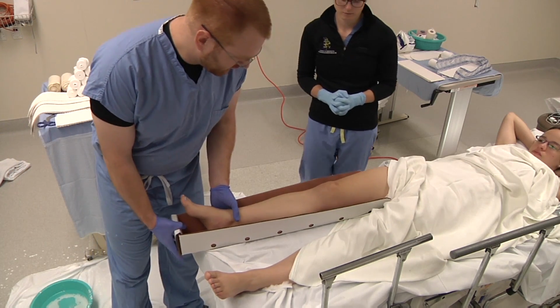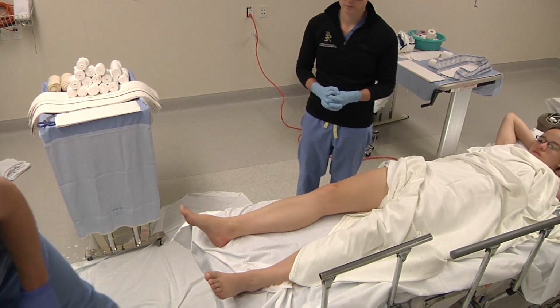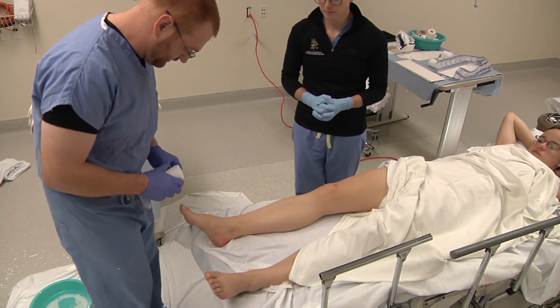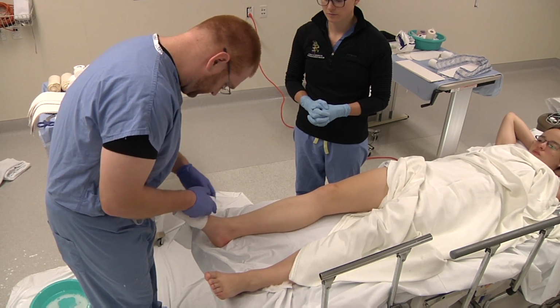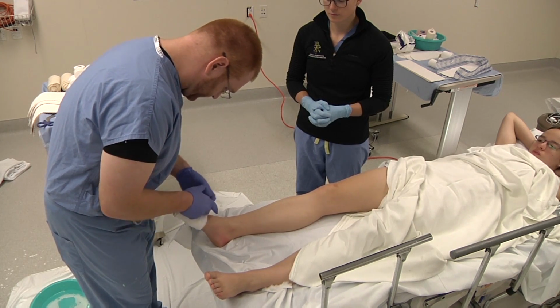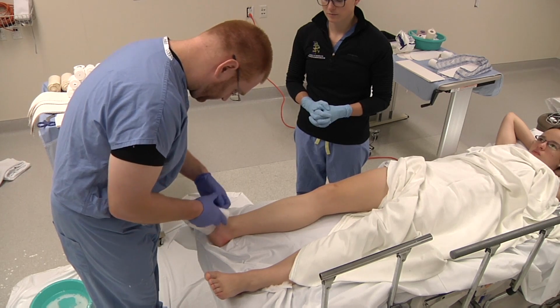Generally at Harborview, people are placing box splints prior to any splinting. Like to do what's easy first. As always, wrap the tops and bottoms of your splint with a minimum of 4 layers.